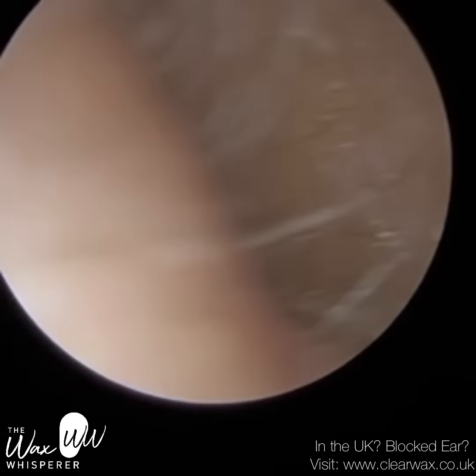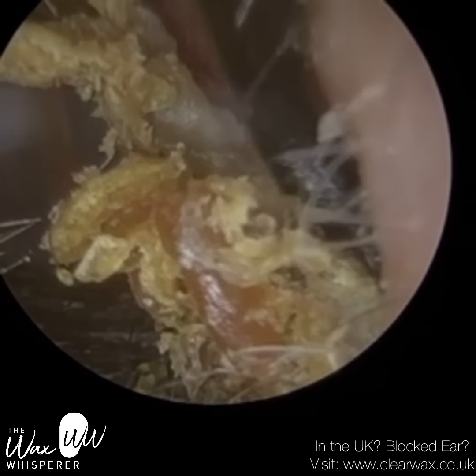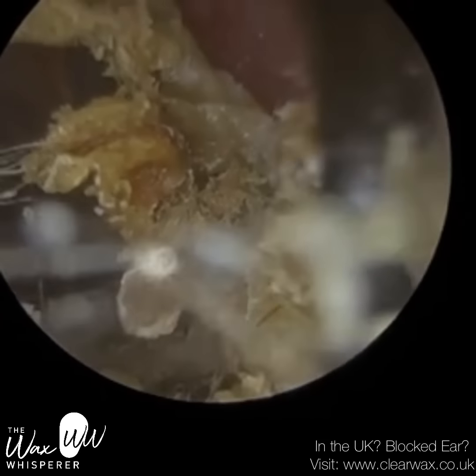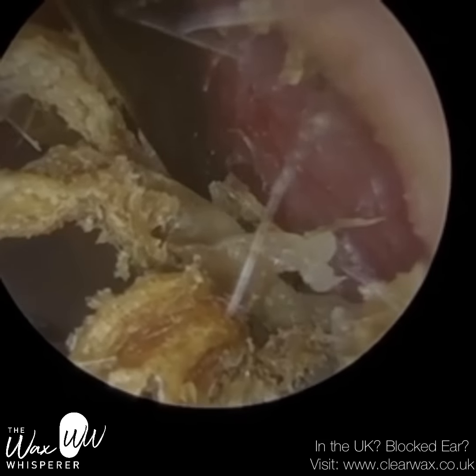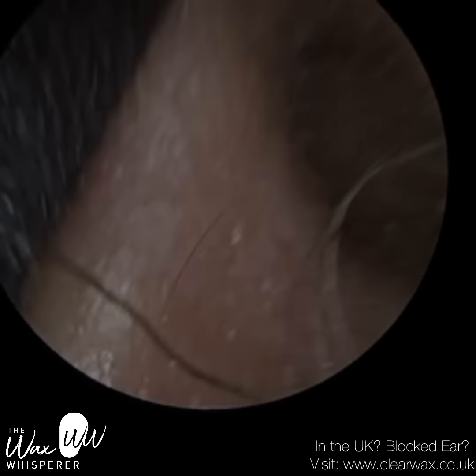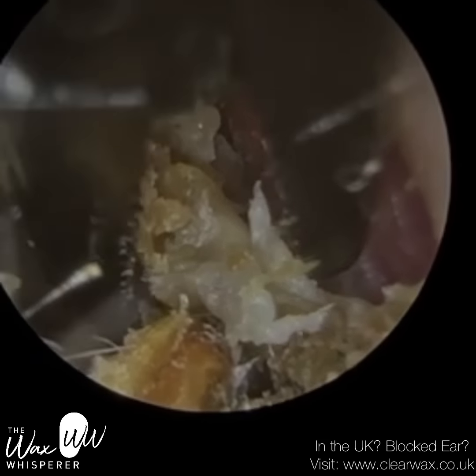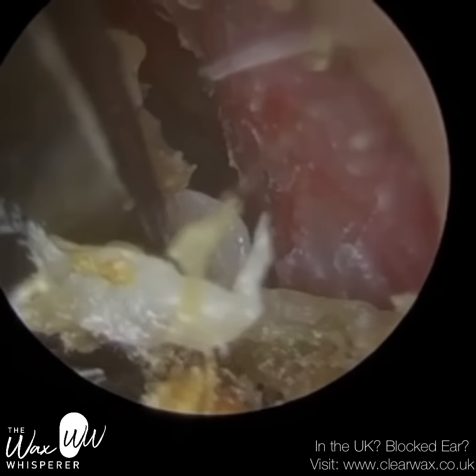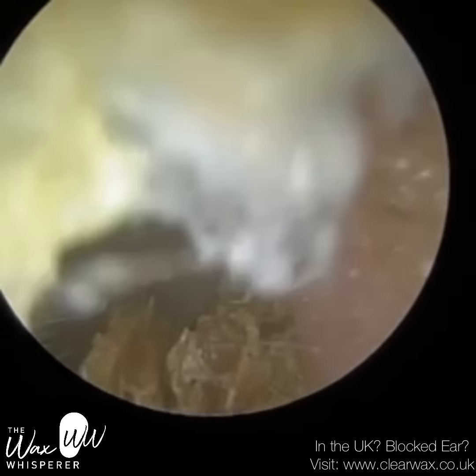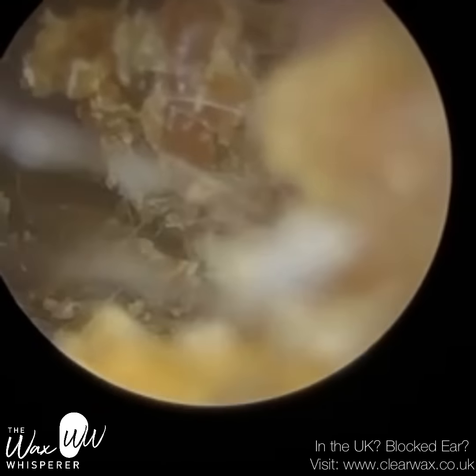And unfortunately, because of these widenings and abnormalities at the base of the ear canal, that's the cause of this buildup. Now, you could say that this is somewhat keratosis obturans, in very early stages, because that's what happens with keratosis obturans. The skin fails to migrate, and it builds up in a plug. But with keratosis obturans, it's more medial, typically in the inner two-thirds, where there is a buildup of dead skin. In this patient there's a buildup in the inner two-thirds as well, but also on the cartilaginous portion.